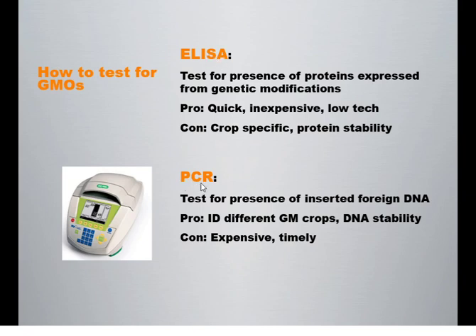PCR is one of those that is expensive, but can be specific for that virus without a lot of prep work. And so this is why some countries were able to get these tests out very, very quickly and be able to start testing people for it right away. Okay, so that is the ELISA.